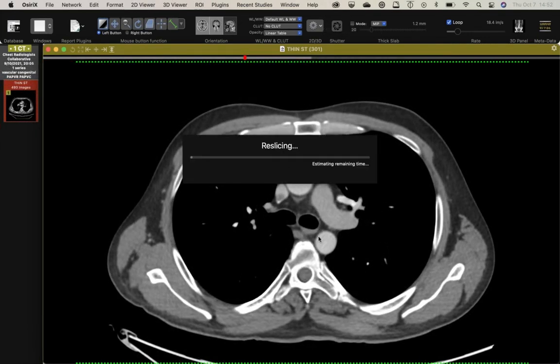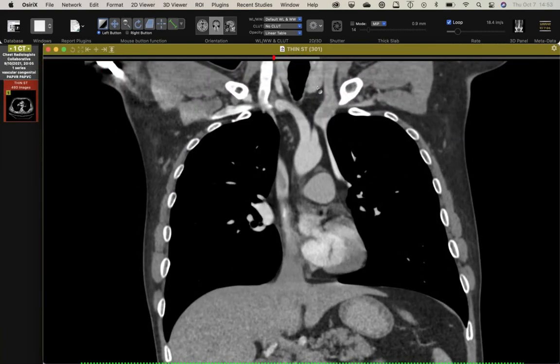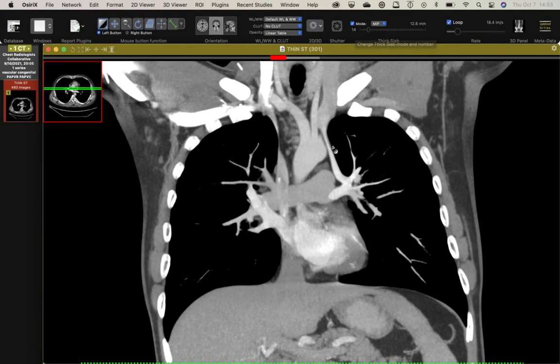I just showed one a few weeks ago, and I think you might have been gone, Travis. Yeah, I was gone a few weeks. Travis educated me because I said I hadn't seen either, and he said, oh, it's a persistent left cardinal vein. Yeah, there it is. The levoatrial cardinal vein. Persistent levoatrial cardinal vein. I'm like, okay.